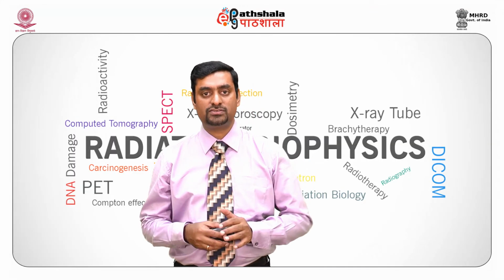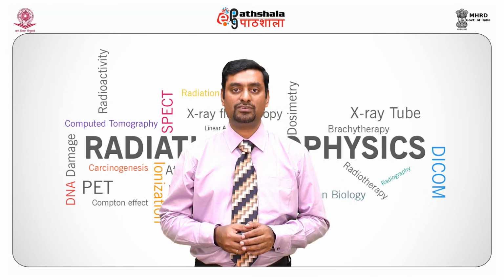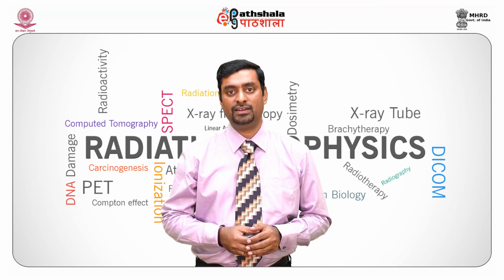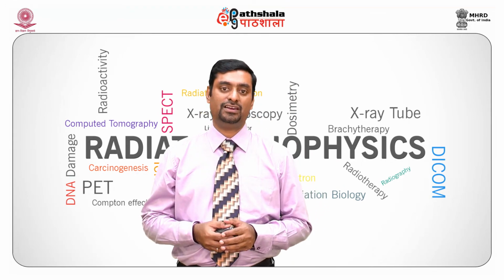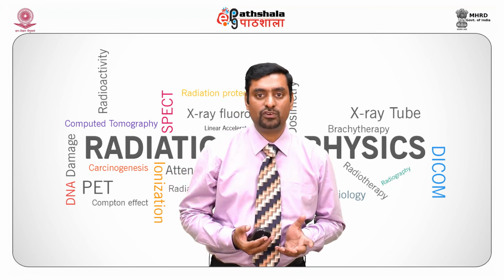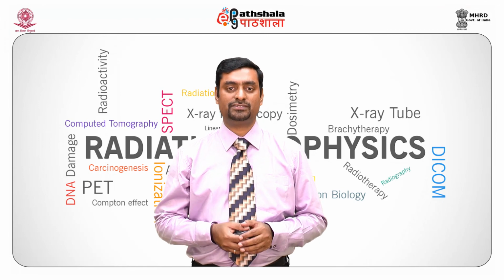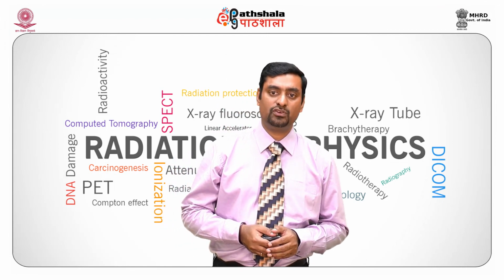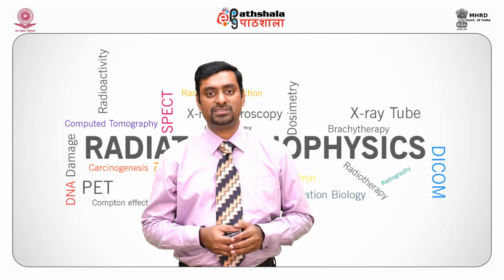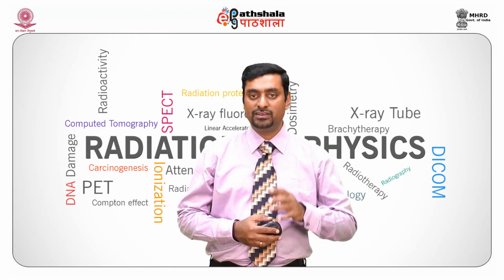I hope you understood a little bit of what fluoroscopy is all about. We talked about conventional fluoroscopy and image intensifier. What is fluoroscopy? It is a radiological examination. Let's summarize. Fluoroscopy is a radiological examination which uses X-rays and a fluorescent screen or a detector to visualize the dynamic process within the body in real time.